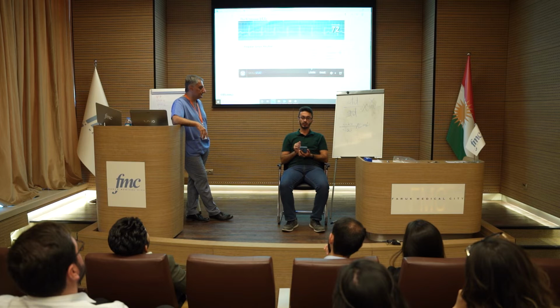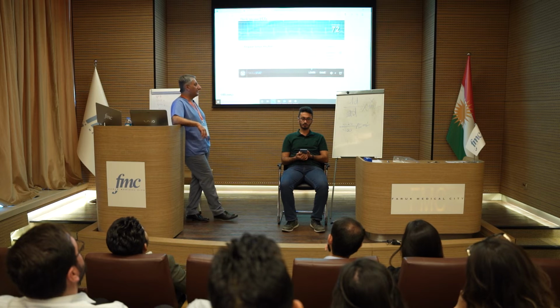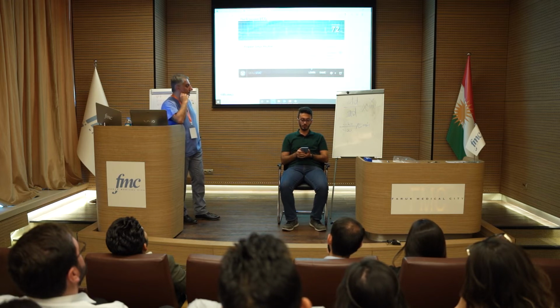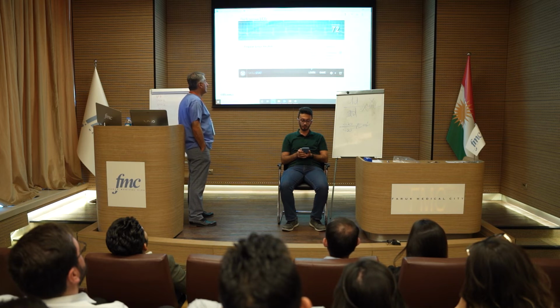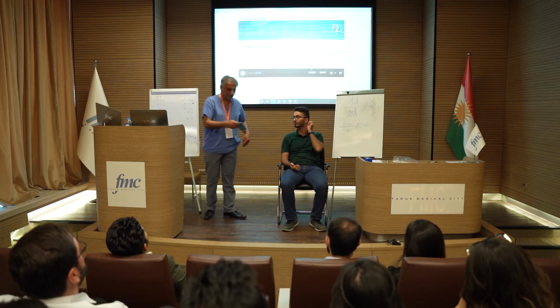Is there any electrical activity? Yes. Okay. What is the ventricular rate? 72. Okay. Is the QRS rhythm regular or irregular? Regular. Is the QRS width normal or broad? Within range. Is atrial activity present? Yes. Okay. How is atrial activity related to ventricular activity? Associated. So this is normal sinus rhythm. Okay, that's an easy one.